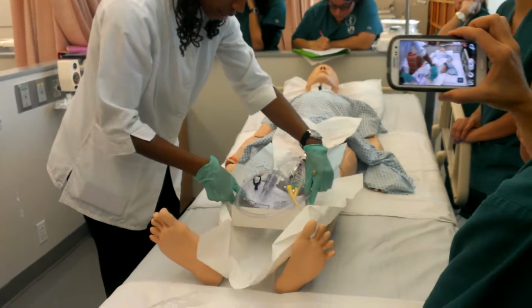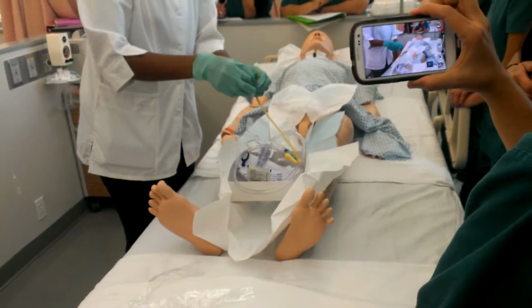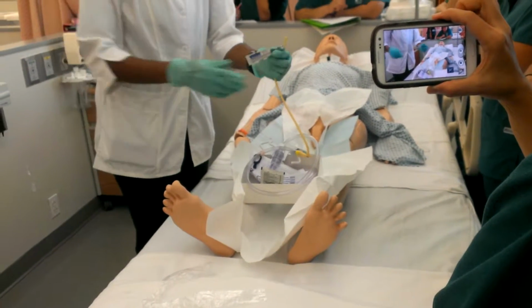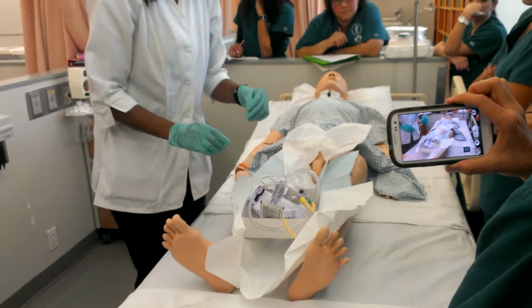So you just have everything set up. You have your swab sticks open. And for this, another trick that you can do, and I'll show you what they do in the live setting, they just open the KY jelly and they just insert it in there. And that just helps when they're awake.